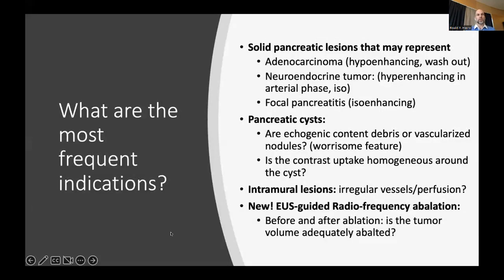So what are the most frequent indications? I think the solid pancreatic lesions is one obvious indication. And we have the adenocarcinoma that is usually hypoenhancing, or it has a washout. We will look at this.